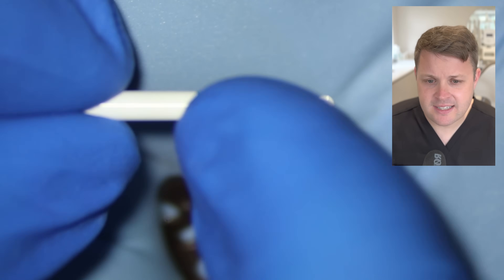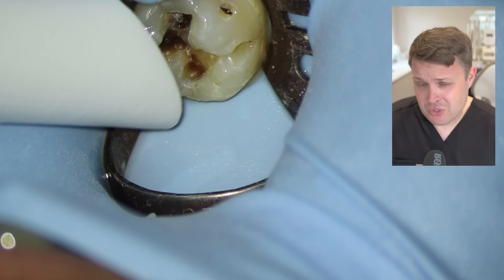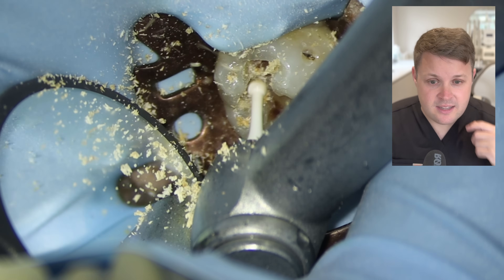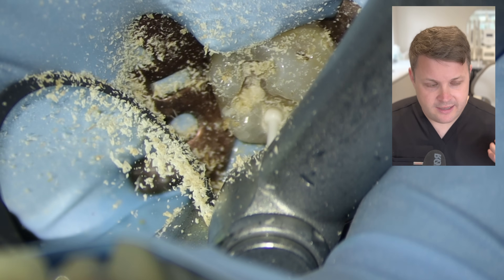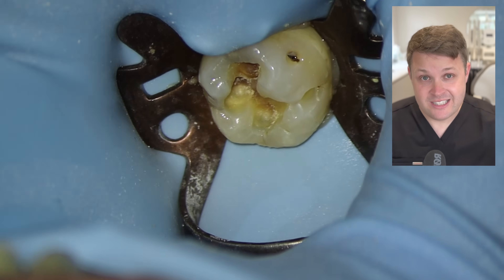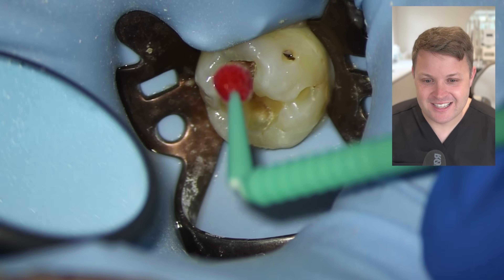And here are these fantastic ceramic burrs. They probably don't look much, but the great thing is that they have great cutting efficiency and they don't vibrate the patient's head into next week. One patient who'd had quite a few fillings said that was probably the smoothest drilling he'd ever experienced — which is absolutely fantastic.